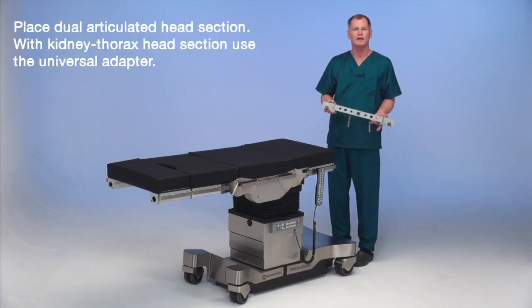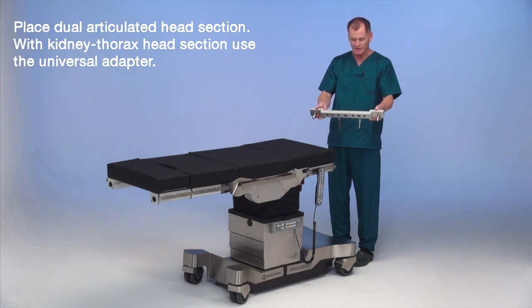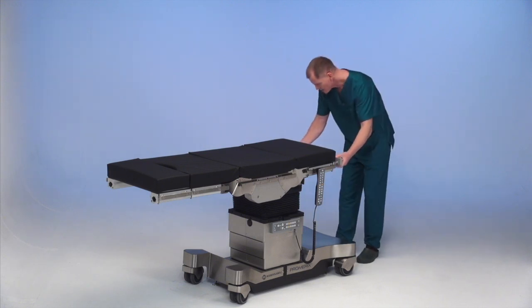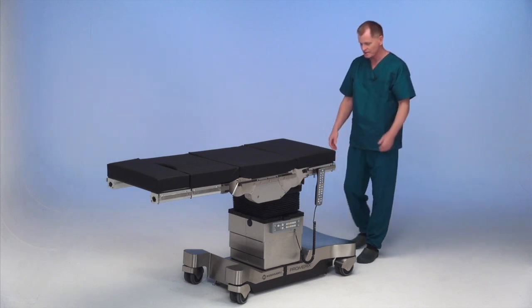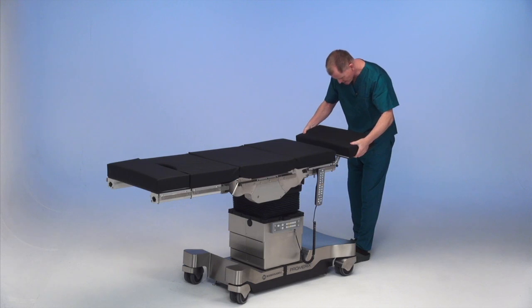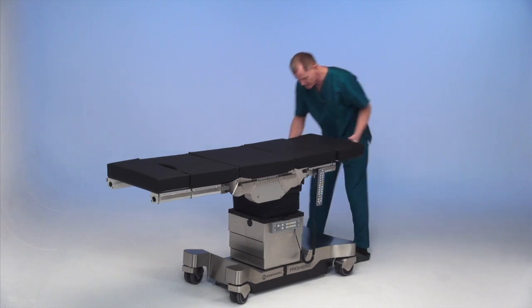Placing a universal adapter on the table for the dual articulating headrest, which requires the adapter. To place the adapter, just like the sections, it's simply male, female, and lock in place — and the adapter is locked into place. Adding the dual articulating headrest onto the table and then tightening it down.